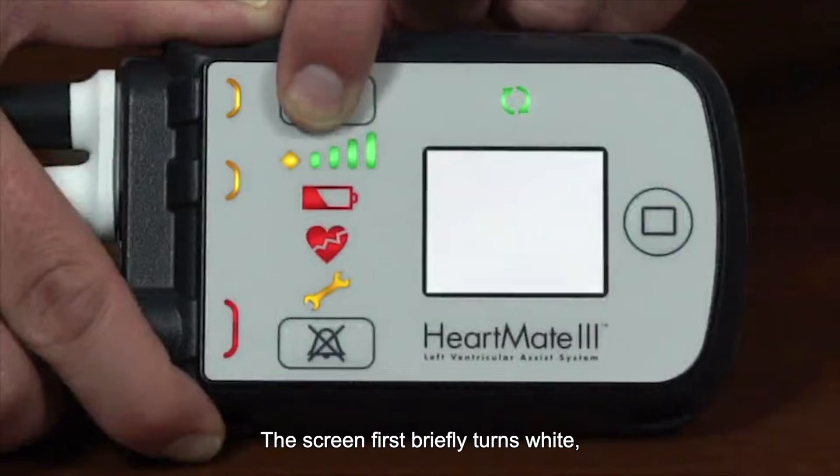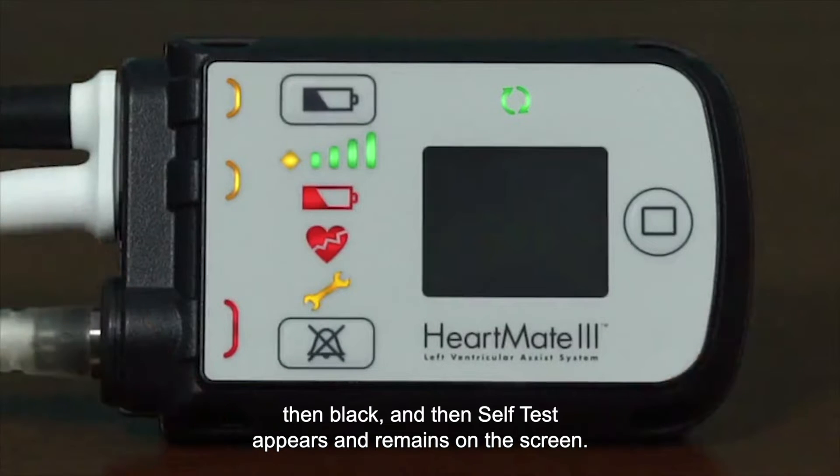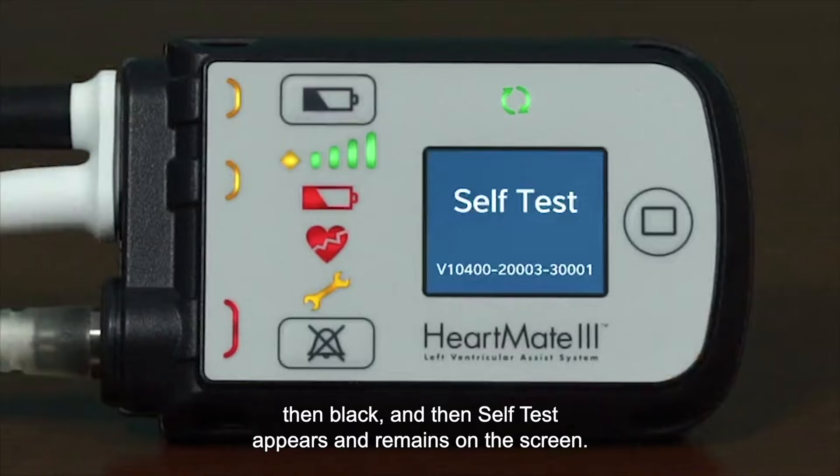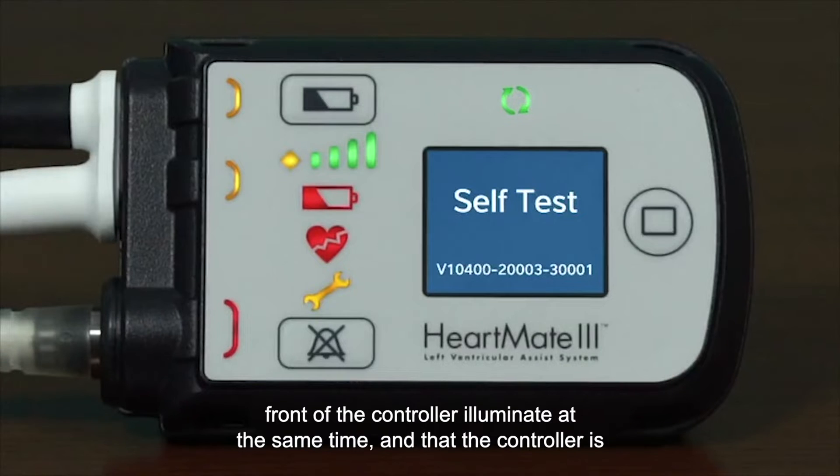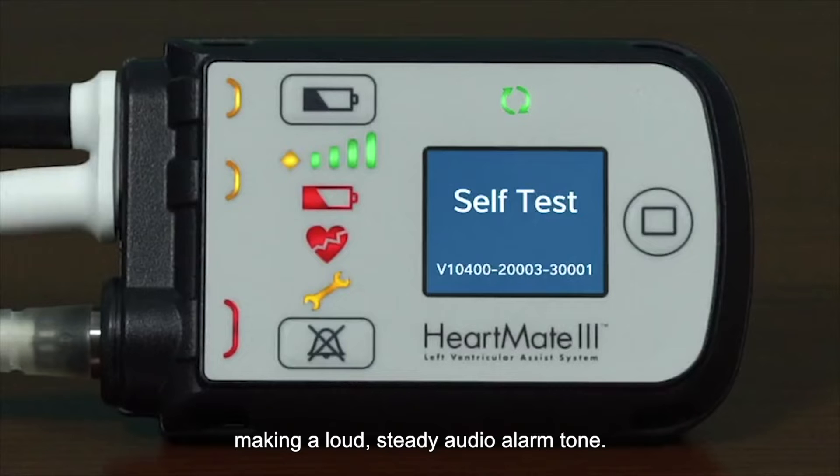The screen first briefly turns white, then black, and then 'self-test' appears and remains on the screen. Release the battery button and check that all symbols and indicators on the front of the controller illuminate at the same time, and that the controller is making a loud, steady audio alarm tone.